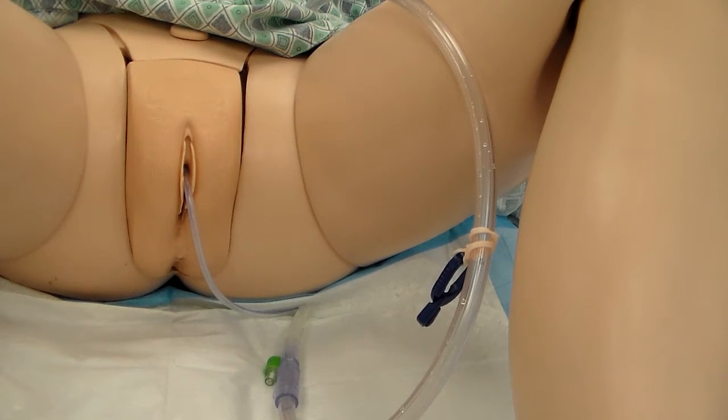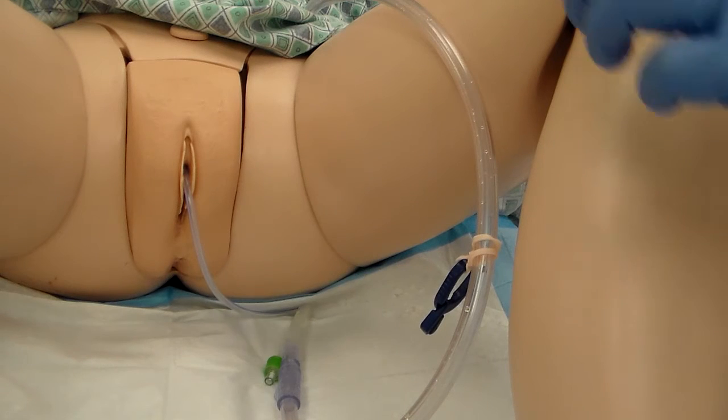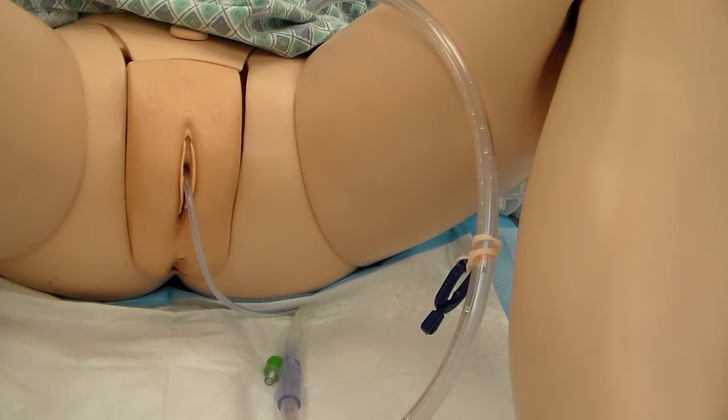Okay. So then what we want to do is we want to make sure that the bag is empty prior to removing the Foley catheter. Why do I say that? Because in a minute you're going to be able to take the Foley catheter and wrap it right into this disposable chucks that's underneath the patient and take the Foley catheter, the bag and everything right to the garbage and throw it all out in one fell swoop. If you forget to empty the bag, then you're sitting there holding a catheter trying to empty the bag, and it's just not as easy for you to empty that bag at that point. So you want to make sure that the bag is emptied prior to removing the Foley catheter, okay?